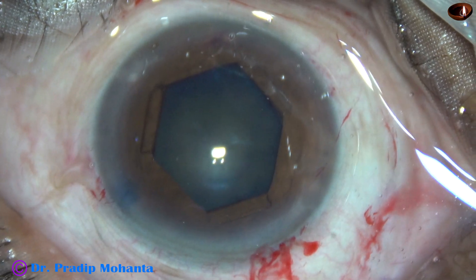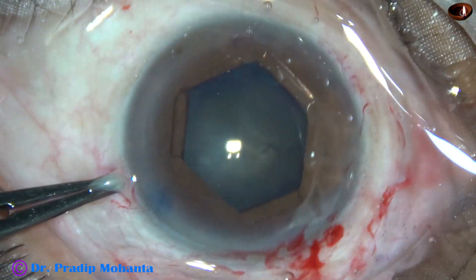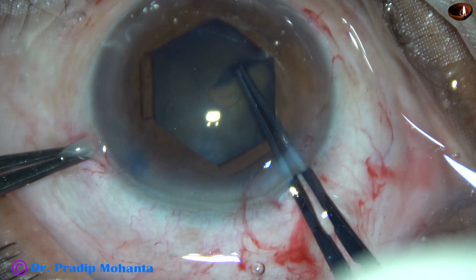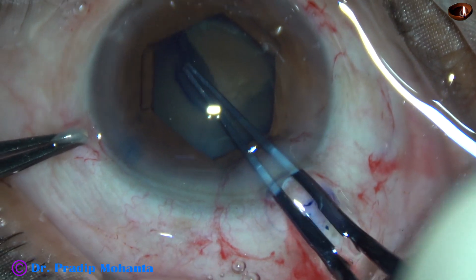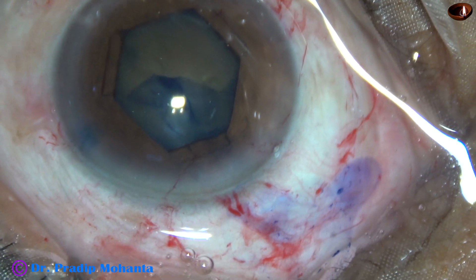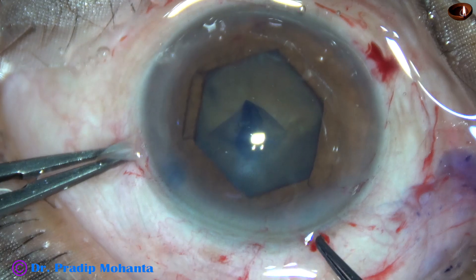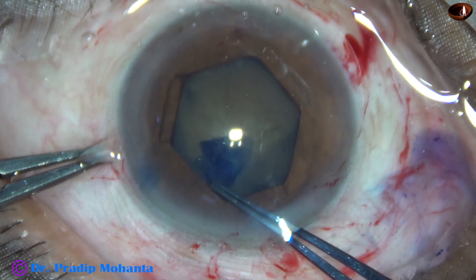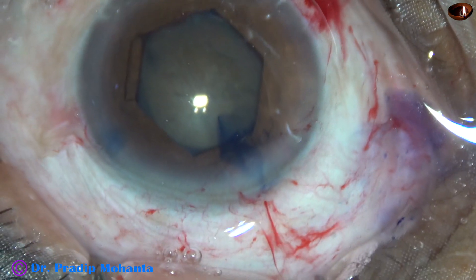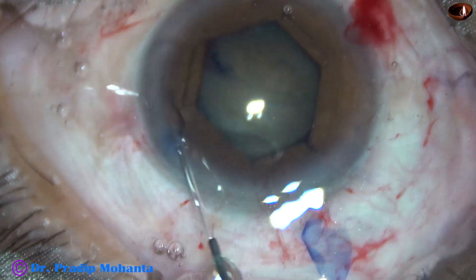This is another side port at around 8 o'clock. The anterior capsule is incised and a capsular tag is raised. I am going to use a capsulorhexis forceps. With the help of this forceps, I hold this capsular tag, go anti-clockwise, and do a rhexis of about 5.5 mm. Since this is a hard cataract with nuclear sclerosis of grade 4 or grade 5, I decided to do a large rhexis.